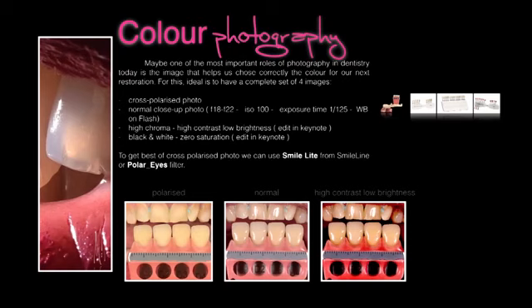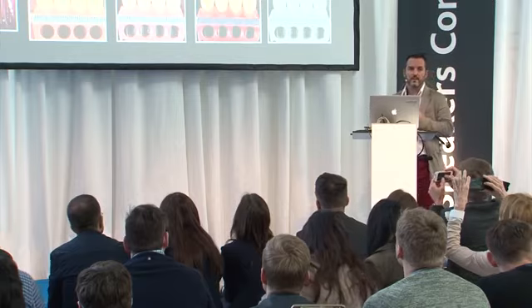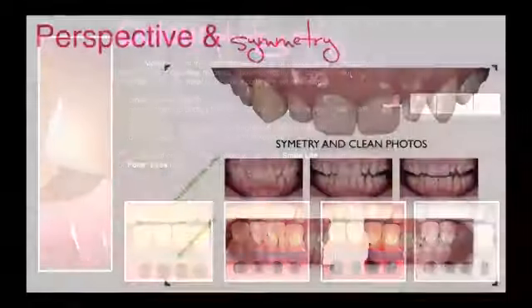Good. And here you can see with high contrast and low brightness, from here we can choose the chroma where we have to add more dentin, more deep dentin, let's say. And here we can see different tones of gray. We can see the value from the color. So basically, if we have these 2 photos, we also have these 2, because we duplicate this photo in Keynote and we get this photo and this photo by doing just this in the settings, high contrast, low brightness, or taking saturation down to 0.